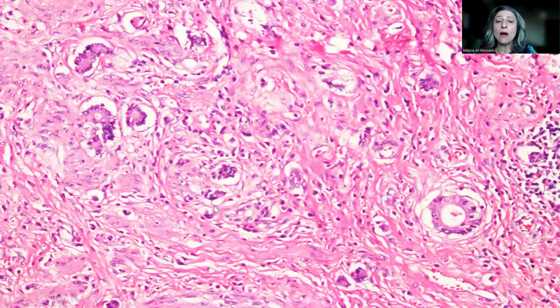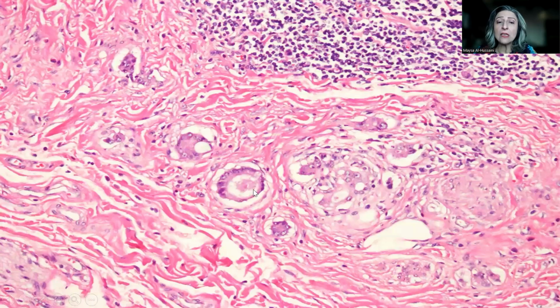And this is on higher power magnification. And as you can see here, very well-formed tubules or glands that are seen infiltrating among the wall, eliciting some degree of fibrosis. And here also very well-formed glands. Now the nuclei are vesicular with small prominent nucleoli, but definitely the nucleoli are clear.